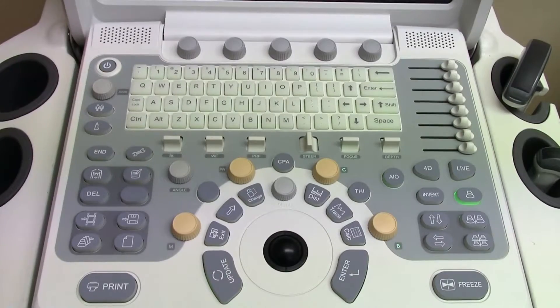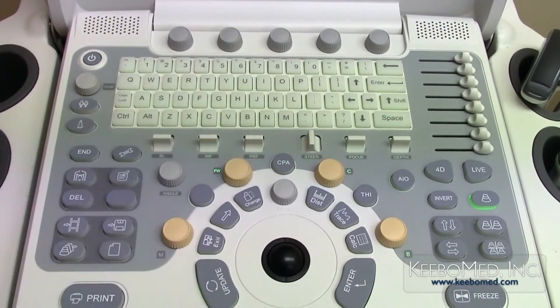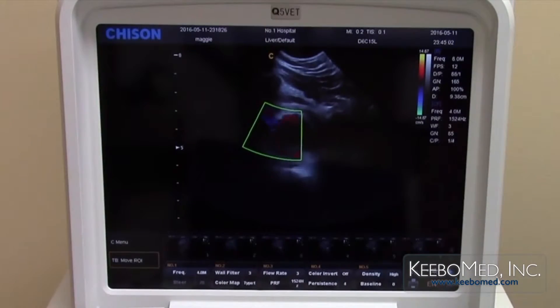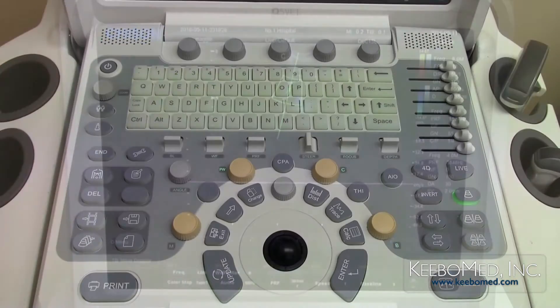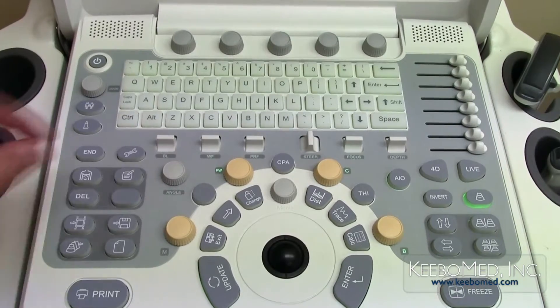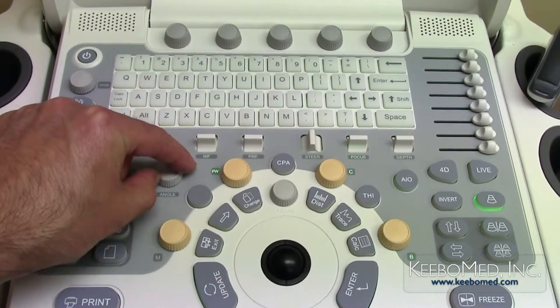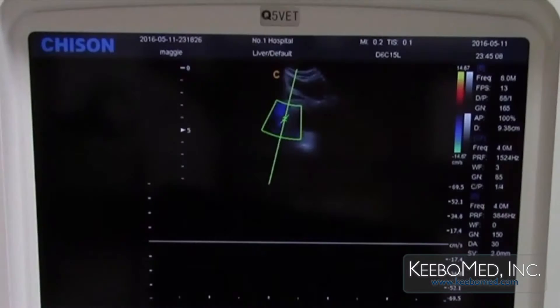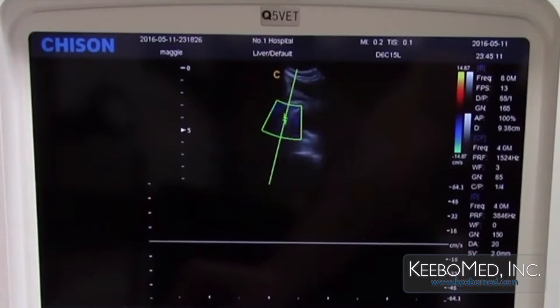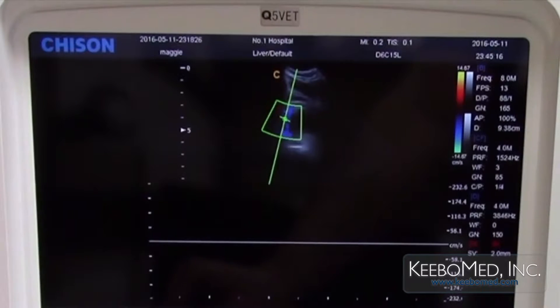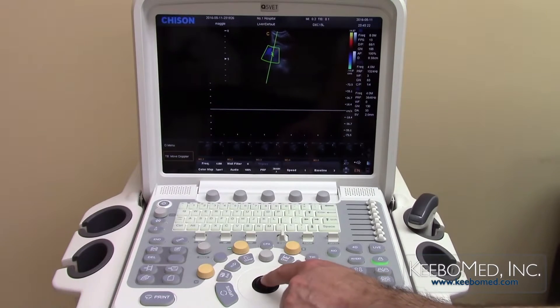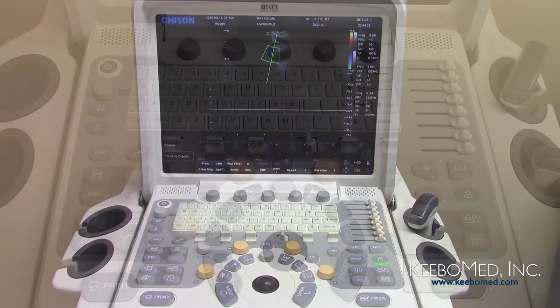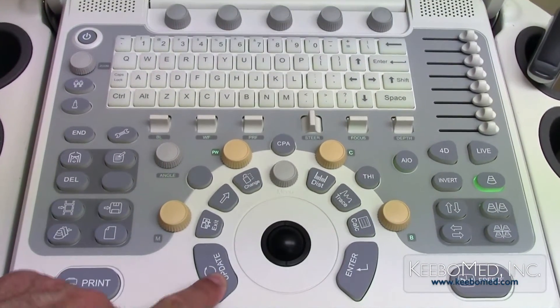To select pulsed wave Doppler mode, press the PW button. The angle can be adjusted up to 60 degrees by rotating the angle button; the angle must be kept at 60 degrees or under. The parameter is shown on the right side of the screen. Moving the trackball will allow the line to be moved into the middle of the blood flow, then press the update key to see the spectrum.